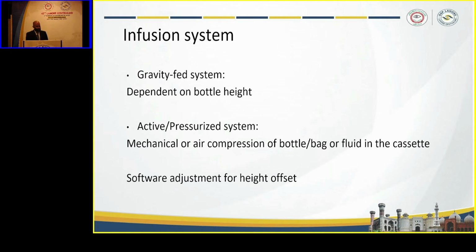With the modern systems, we have a software adjustment for the offset in the height of the bottle or the bag.